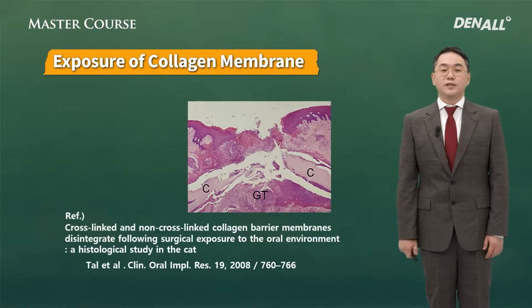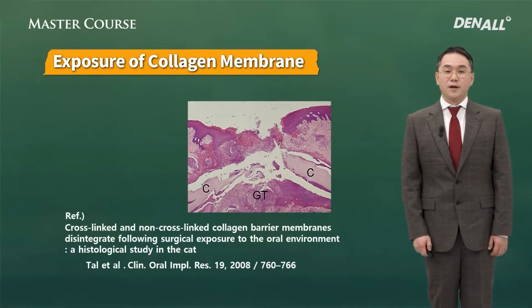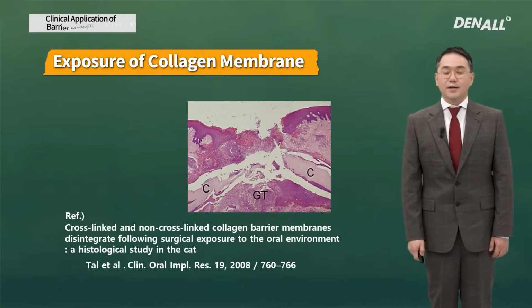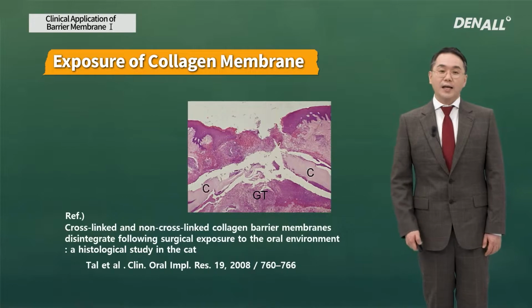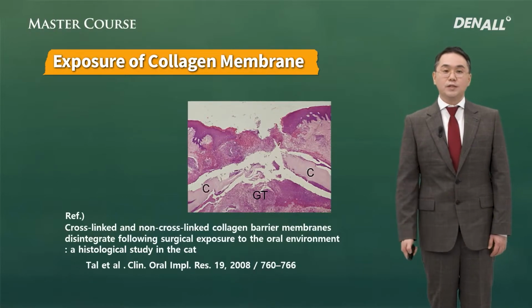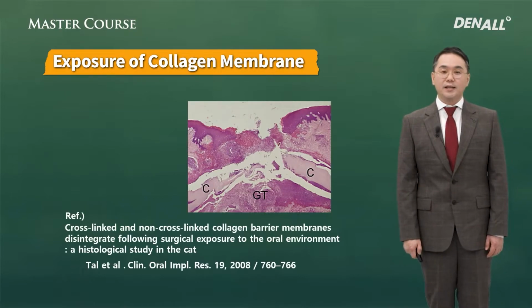As you can see in this paper, histologic picture, when collagen membrane is exposed, epithelialization occurs well above. As you know, collagen is used as a dressing material for soft tissue, but during GBR, it is not used for epithelialization. It is used to facilitate the bone regeneration below.